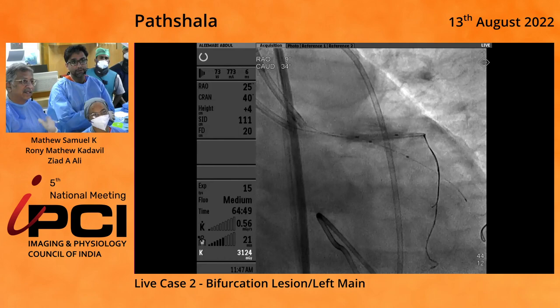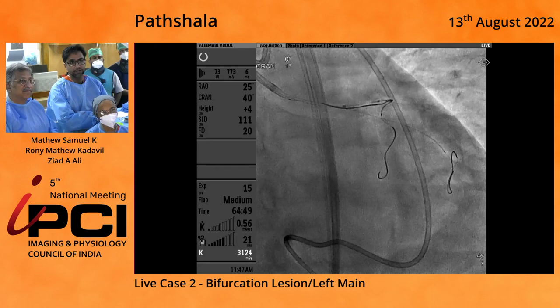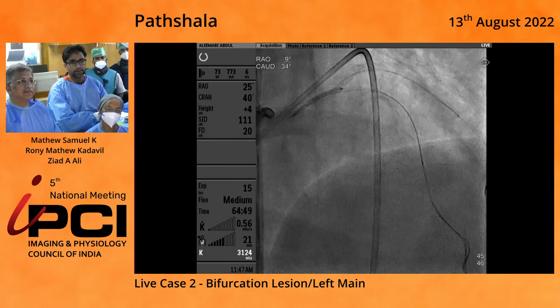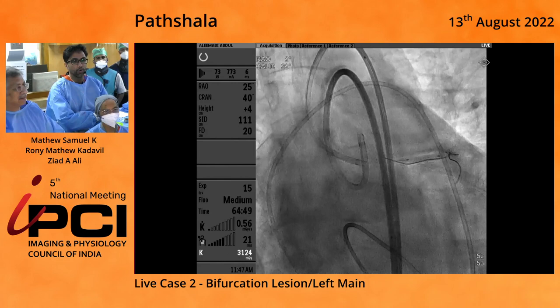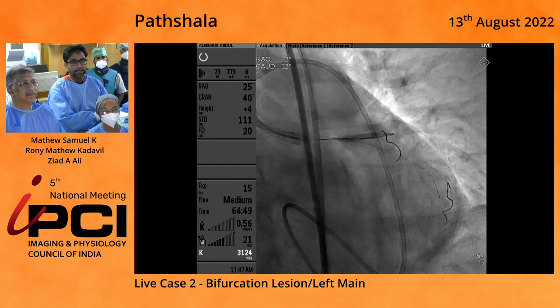We obviously can't jail the circumflex. Ronnie's pushing as hard as he can - you can see it's caught on the struts. During this time, the patient had repeated episodes - probably 20 episodes of ventricular tachycardia. At least 20. So the team here did an amazing job - gave amiodarone and stabilized the patient. We were calling for ECMO.